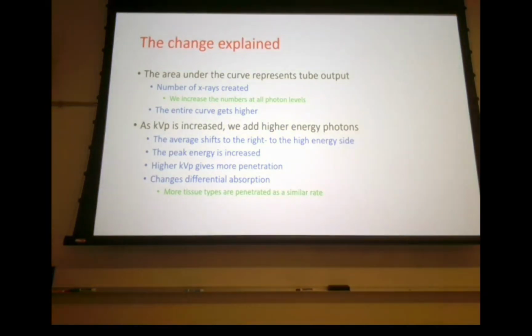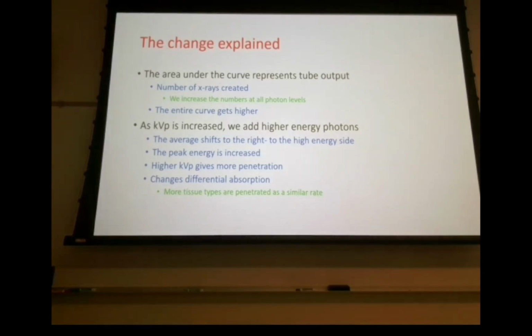As kVp increases, we add the higher energy photons, but we keep all those low energy photons as well. So it shifts to the high energy side. The peak is increased. Higher kVp gives us more penetration and changes the differential absorption.